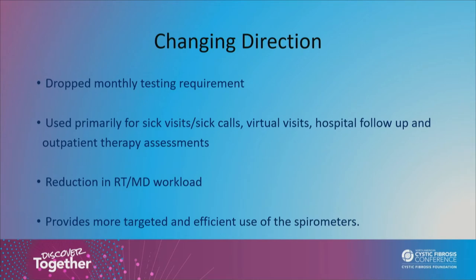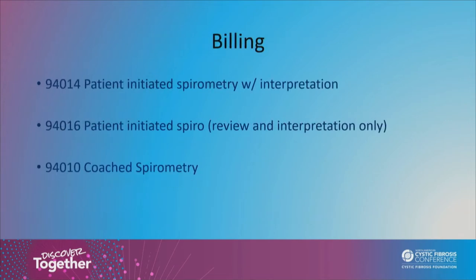we could continue on with the other part of our plan, which was sick visits, sick calls, virtual visits during the pandemic, and then later on, we still have patients doing virtual visits, hospital follow-ups, and assessing any outpatient therapy, whether that's antibiotics or just increased airway clearance. And this really reduced our workload. Less phone calls. We told the doctors not to worry about the dashboard, that we would check it multiple times a week and let them know if their patients were testing, and just streamlined it a little bit. And this provided much more efficient use for our spirometers.